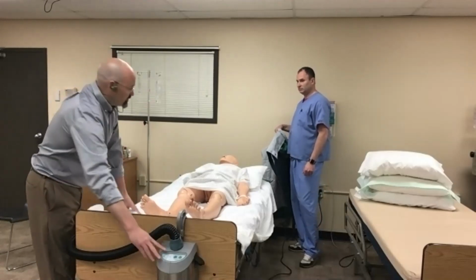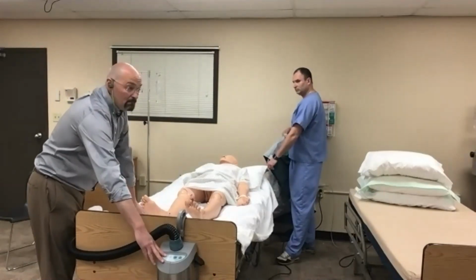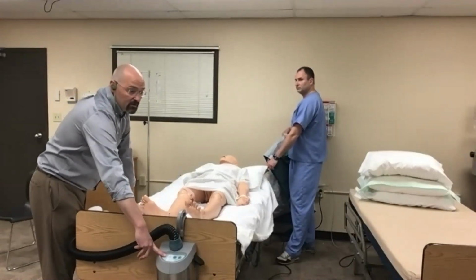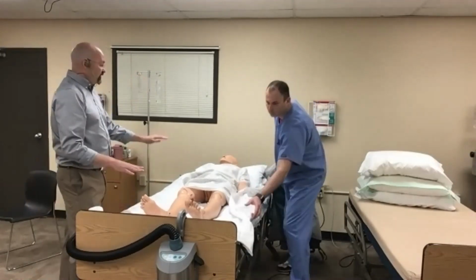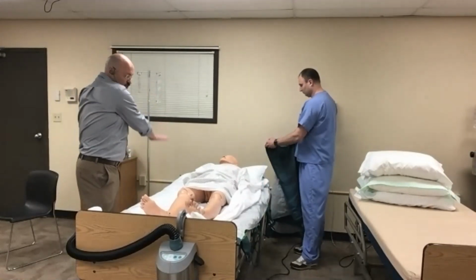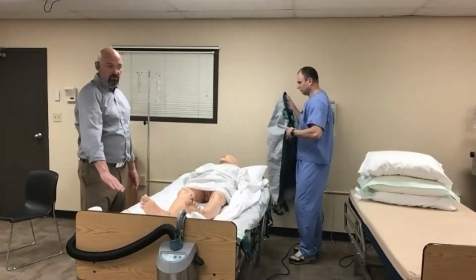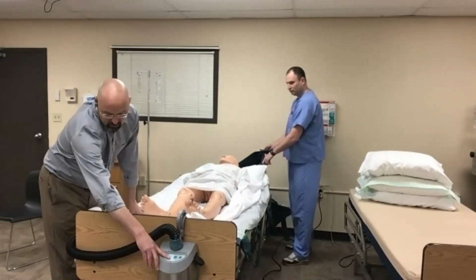So the first thing we do is I'm going to ask Mark to hold on to the mat. Excellent. This takes a minimum of 4 caregivers, 2 to hold the mat itself and 2 to apply the new mat. We're going to show you how that works. We're going to take this mat, inflate it, start at the head and slide the new mat directly in that cushion of air between the 2 surfaces. So he's going to be at the head there. He's going to say, Chris, turn it on.